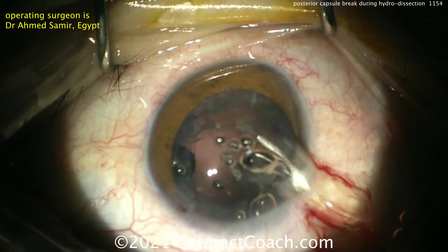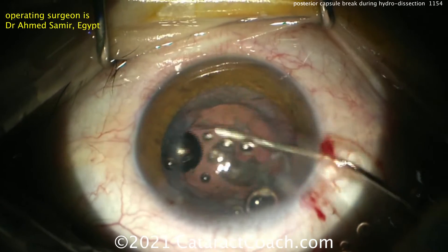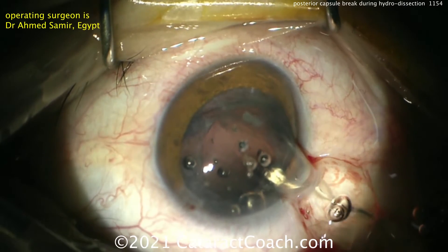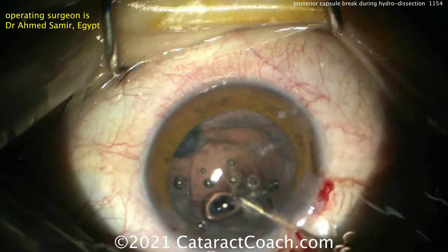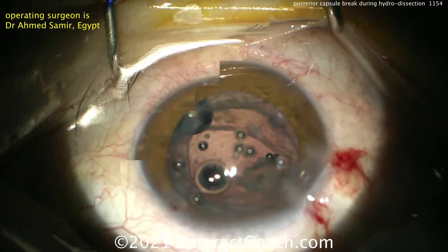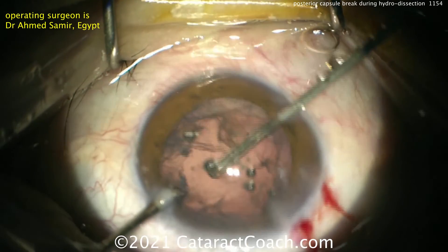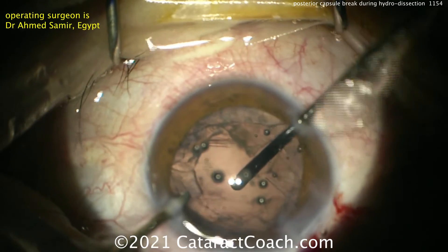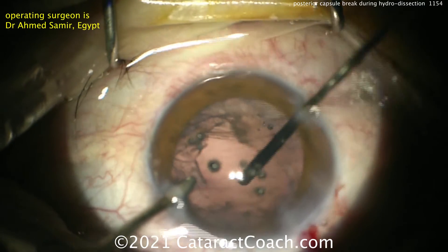The question is how much vitreous has prolapsed into the anterior segment. You're going to need to do an anterior vitrectomy and clean that up. Use Triamcinolone to stain the prolapsed vitreous. He's using a lot of viscoelastic — viscoelastic is much cheaper than vitreous. He's trying to minimize the amount of vitreous prolapse. Looks like a small-gauge vitrector is going in to clean up any remaining lens material and also clean up the prolapsed vitreous. You really need to make sure there is no vitreous prolapse to the front of the eye.